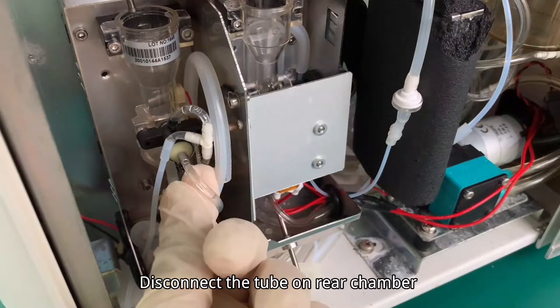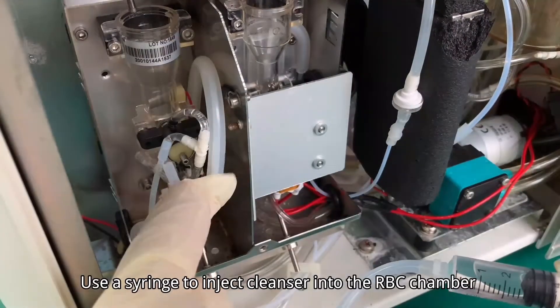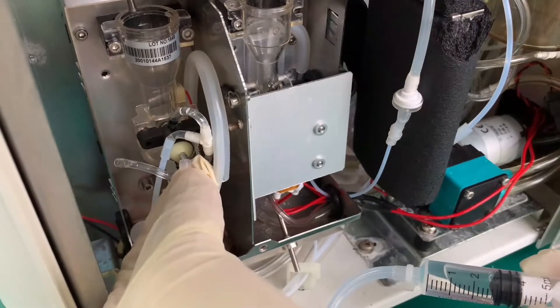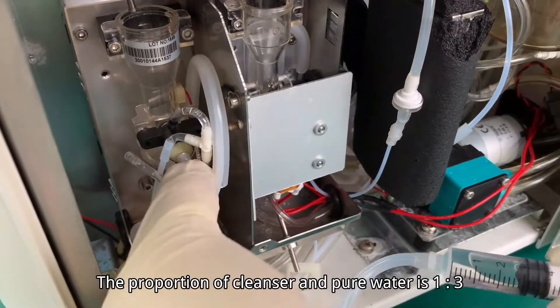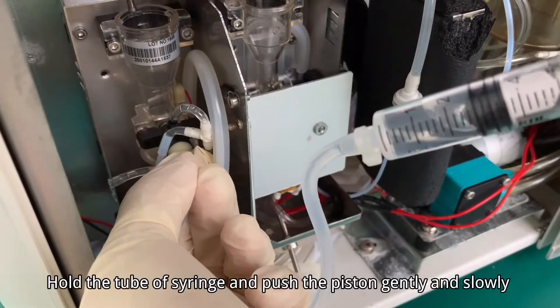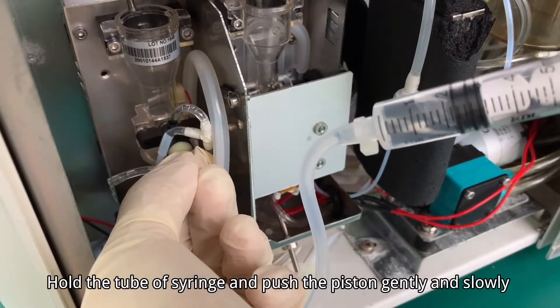Disconnect the tube on the rear chamber. Use a syringe to inject cleanser into the RBC chamber. The proportion of cleanser and pure water is 1 to 3. Hold the tube of the syringe and push the piston gently and slowly.